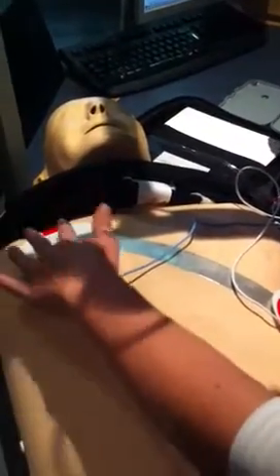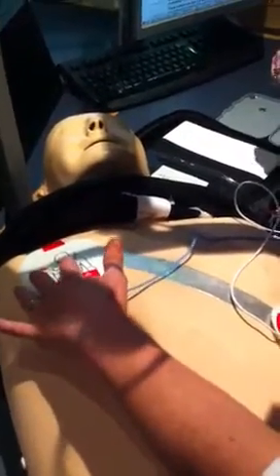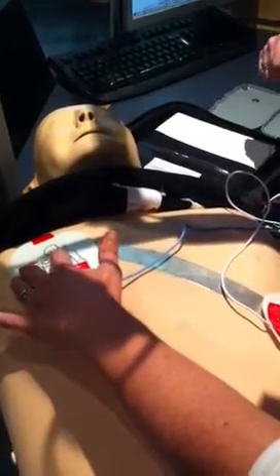So this is exactly what would have been done on Fabrice Muamba over last weekend. Yeah. Just this setup. And this is what helped to save his life? Yeah. Most definitely. It kept all that oxygenated blood circulating. And at this stage then, hopefully, help will have arrived, the ambulance will have come, and they know to take over from here, and they can work from there.